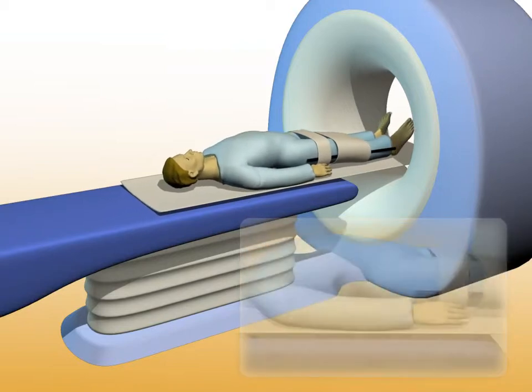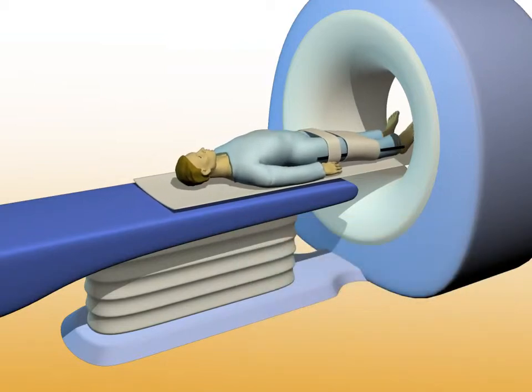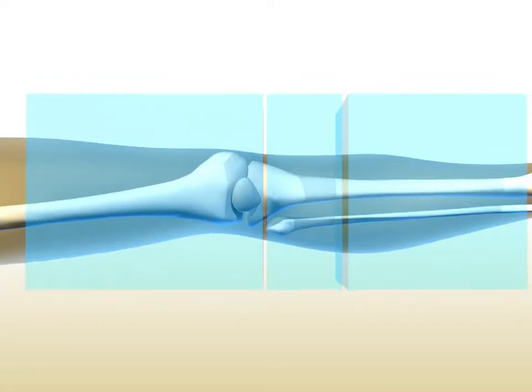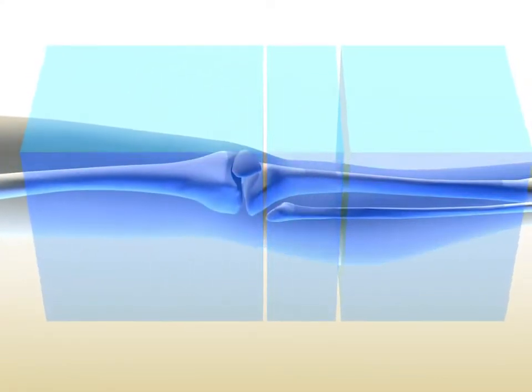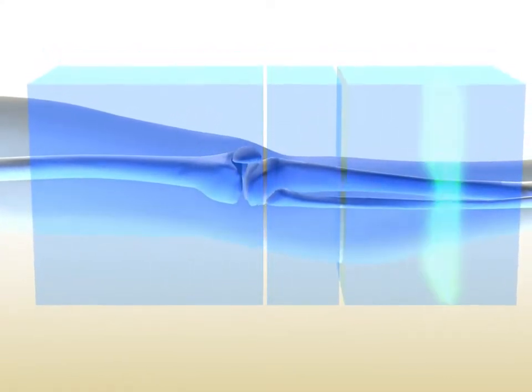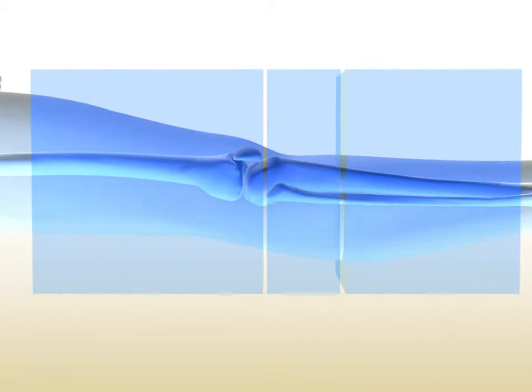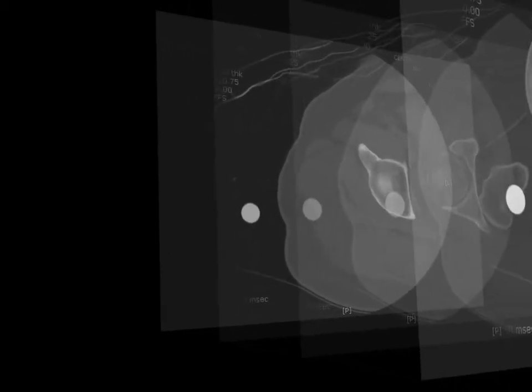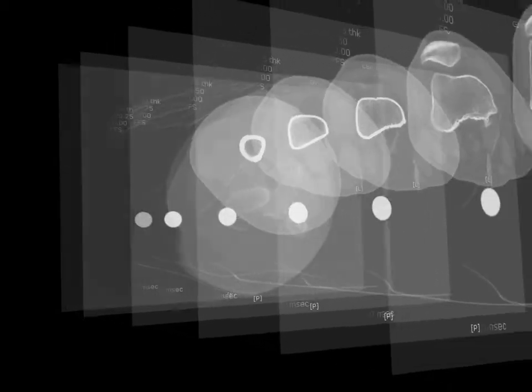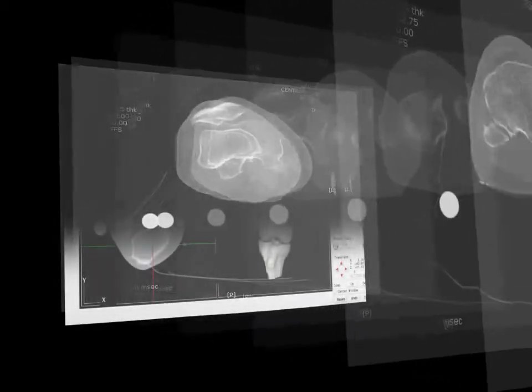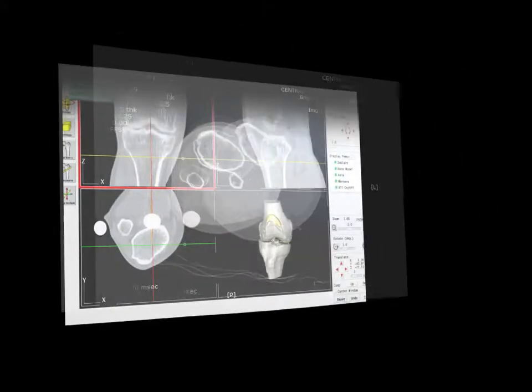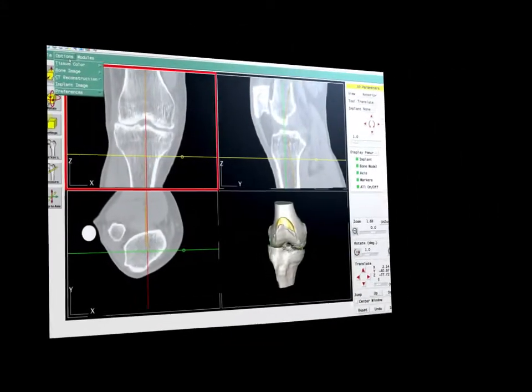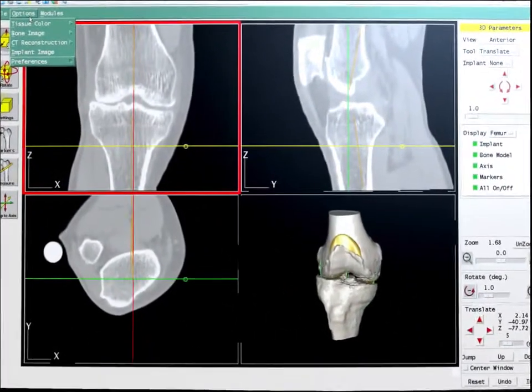Prior to surgery, we'll take a CT scan of the patient's leg. The CT images will be sent to OrthoDoc and transformed into 3D images for planning the surgery. OrthoDoc creates 3D images of the patient's anatomy from the CT scan. This helps the doctor plan the surgery accurately and precisely.